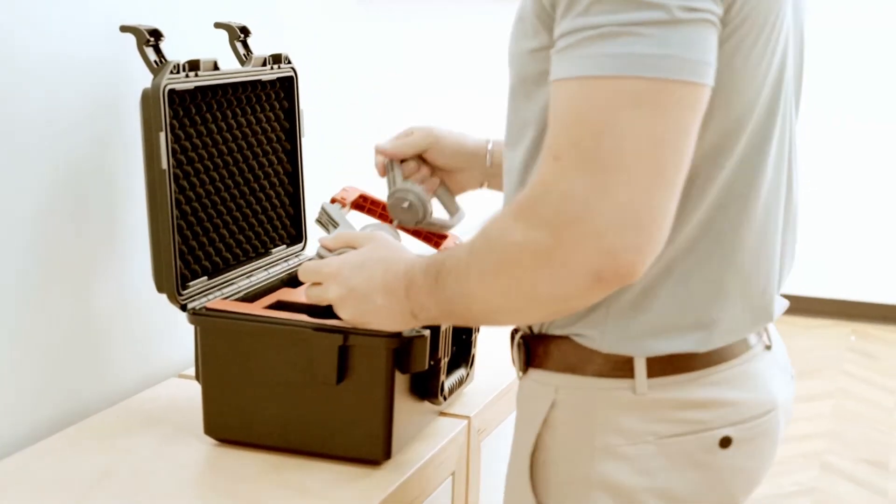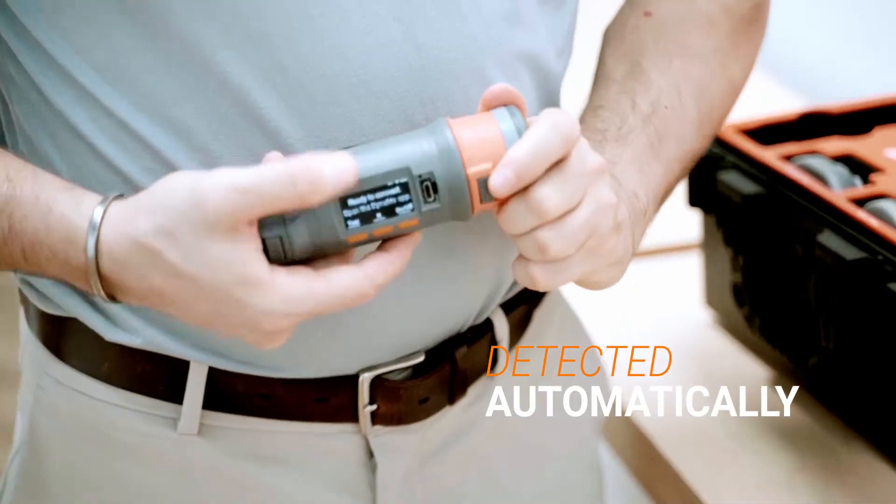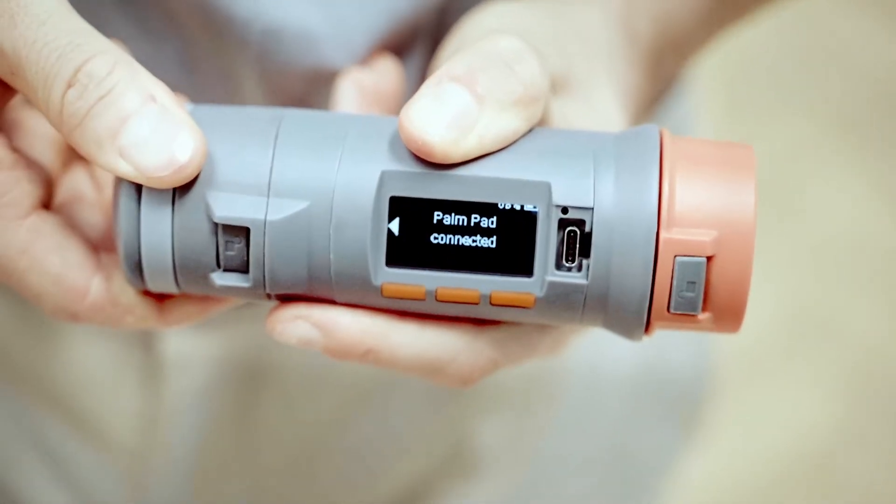Attached with a simple click, Dynamo's smart attachments are detected automatically and indicated by convenient alerts from adaptive interfaces on both its built-in screen and the Dynamo mobile app.